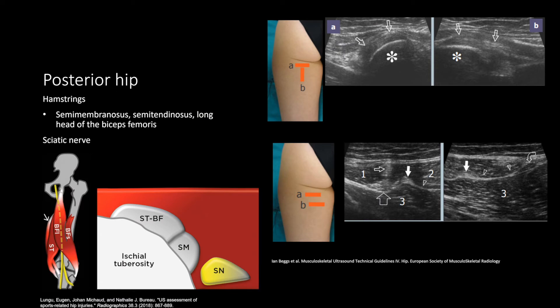At the posterior hip, we'll be examining the hamstrings and the sciatic nerve. Lay the patient flat on their belly. Find the ischial tuberosity, which is the main landmark and the attachment of the hamstring muscles. Lateral to this, you can find the sciatic nerve emerging from under the piriformis. If you shift the probe more inferiorly, you can start to distinguish between the conjoined tendon of the semitendinosus and biceps femoris and the tendon of the semimembranosus.